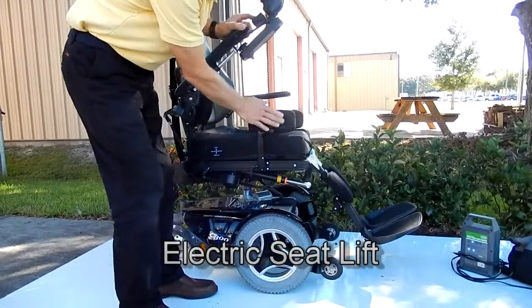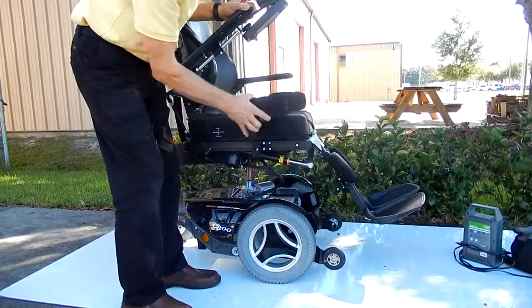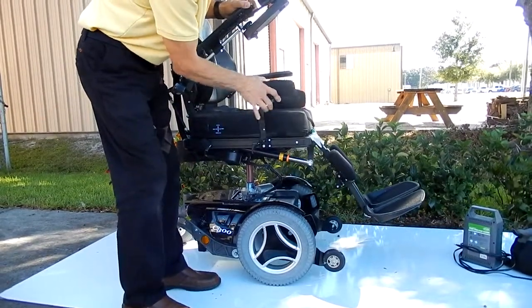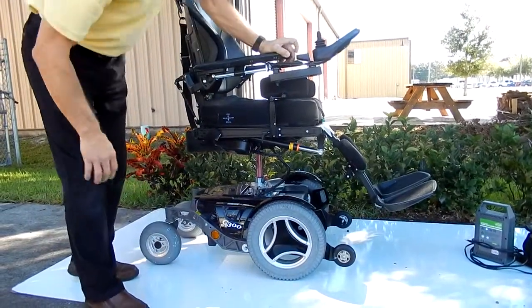It has side pads over here that can be removed. If you don't need them on the seat, you can remove them. It does have solid tires all the way around. Here is your 8-inch seat lift.